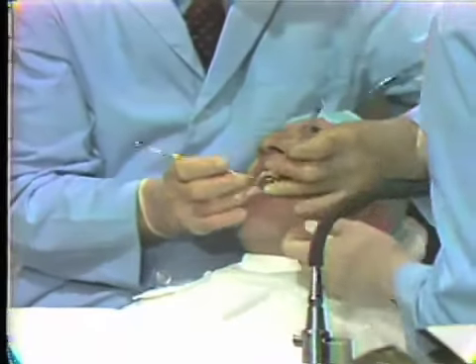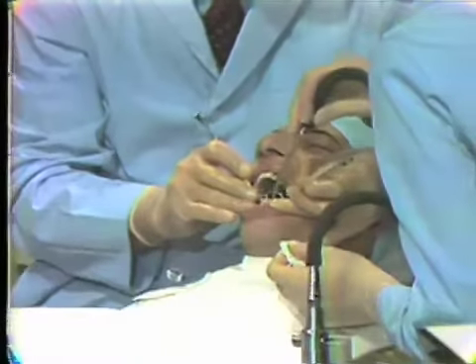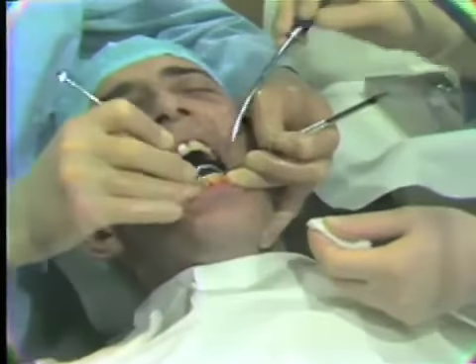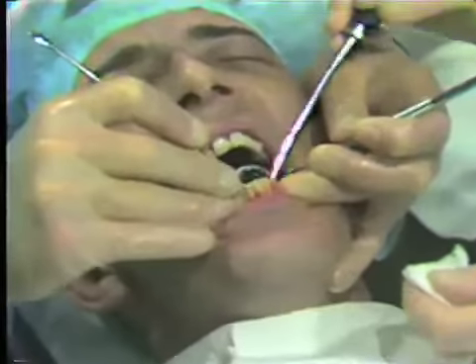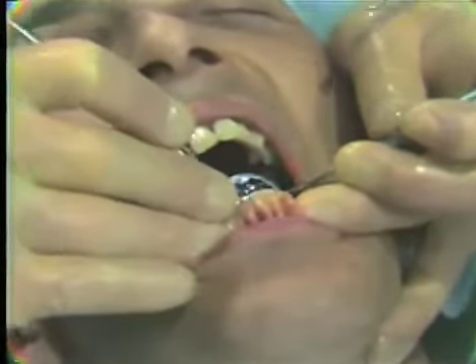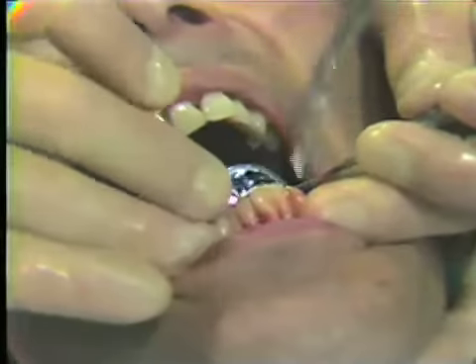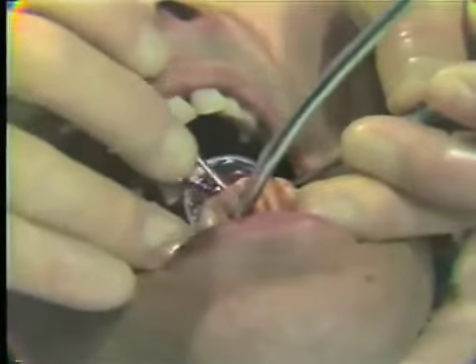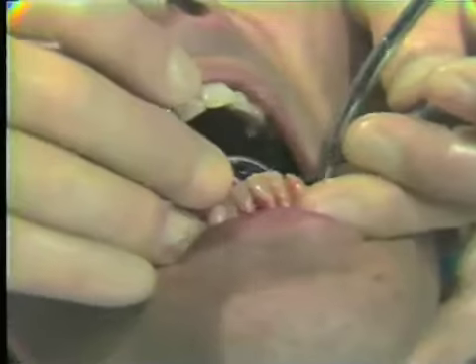There are times when we'll move from the 8 o'clock position of the chair, rolling around to the approximate 11 o'clock position of the chair. This affords me a better view of the area that we need to see. It also permits the assistant to view the area somewhat better in many cases.